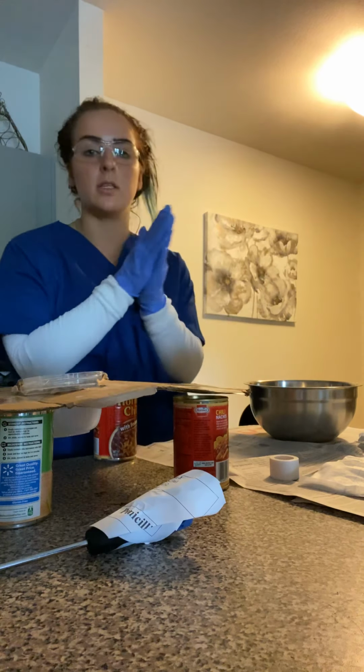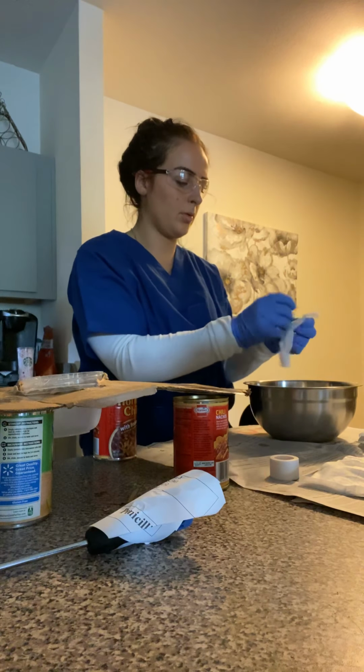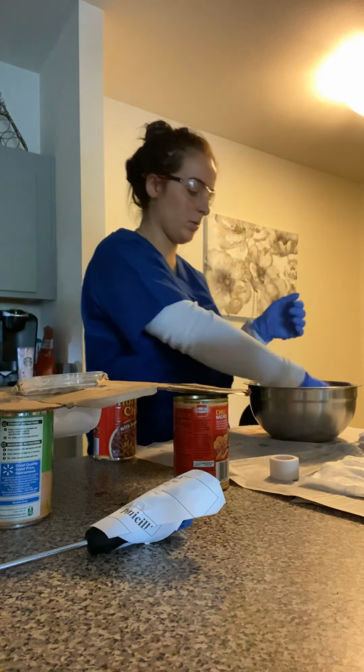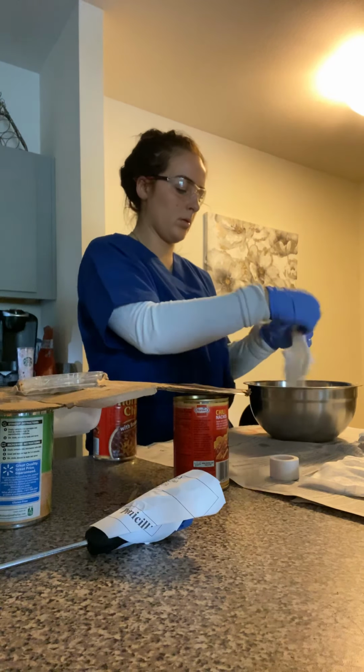So at this point, I'm going to start taking my gauze and getting off the excess and start putting them in my wound. Making sure when you place them in there that you are not contaminating or touching the wound to cause contamination, and that you're also not getting solution all over the patient to cause discomfort. There we go.